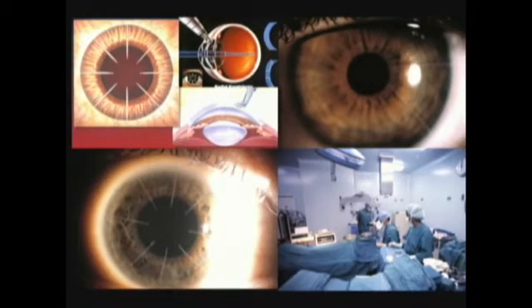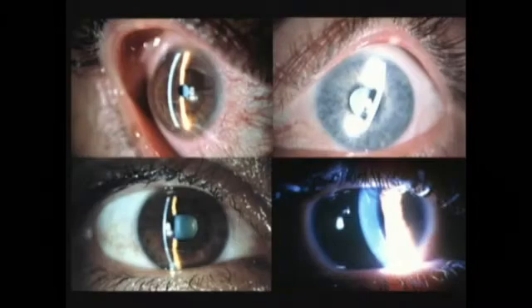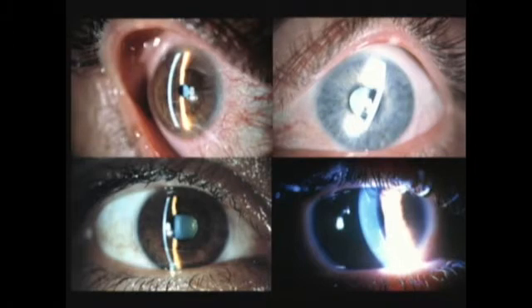This is the operating room that we had in our clinic in the 80s and beginning of the 90s. We did about 14,000 radial keratotomies in the country. Also, we have the astigmatic incisions, whose length will depend on whether it was a compound astigmatism, and whether the spheric equivalent was negative or positive.